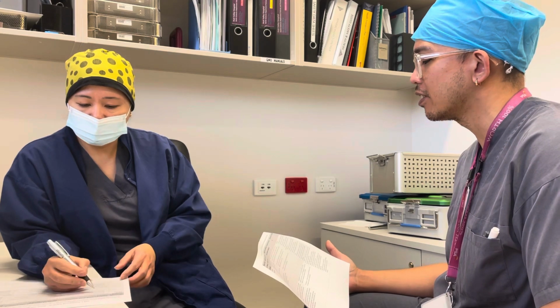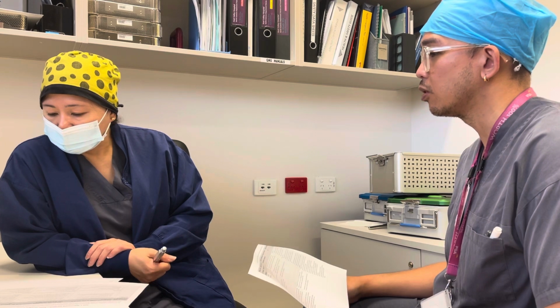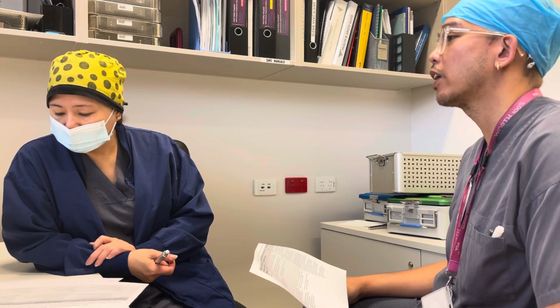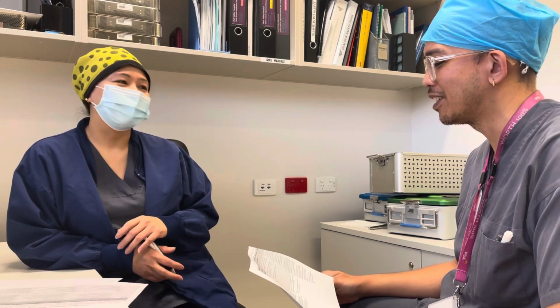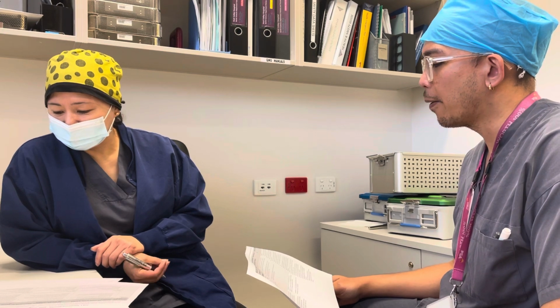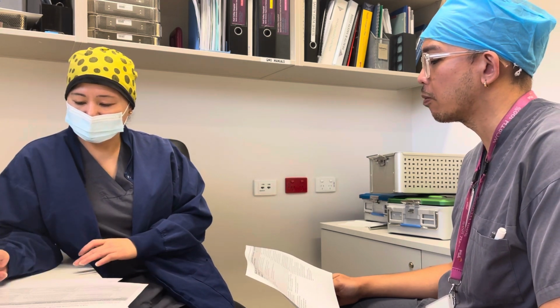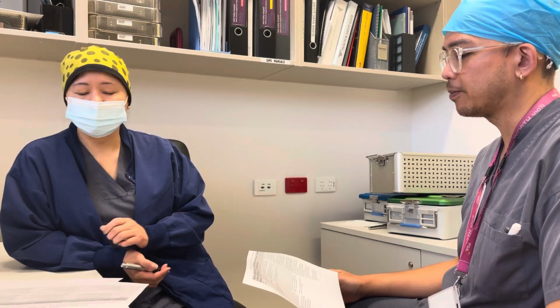reprocessing of medical devices that are intended for single use only and that have been in contact with blood, tissue, or body substances. It doesn't apply to reprocessing of RMDs contaminated with transmissible spongiform encephalopathies, including Creutzfeldt-Jakob disease. It doesn't apply to sterilization of bandages and dressings. It doesn't apply to items not intended to be used in medical devices, in places that manufacture reprocessing equipment, and in places that manufacture chemical and biological indicators.